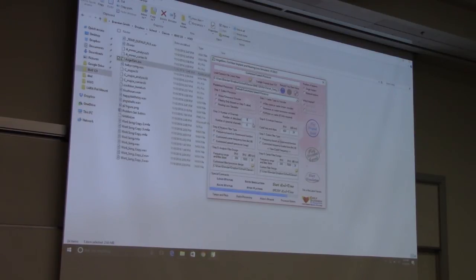Oh, that's not quite going to do it. There's 18 channels. And then we need to tell it to use our files. Then we'll start the simulation. That's going pretty fast. That's good. Okay, let's see.